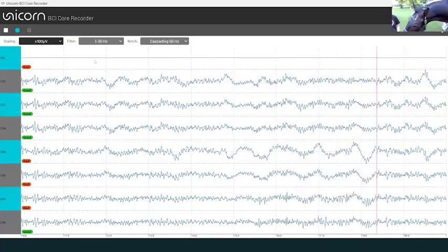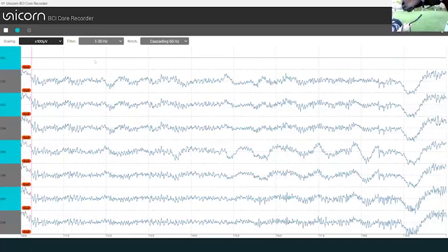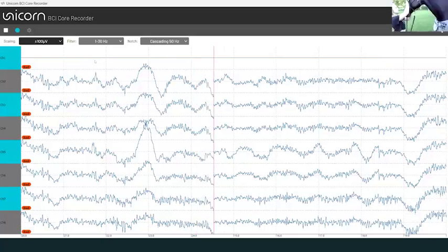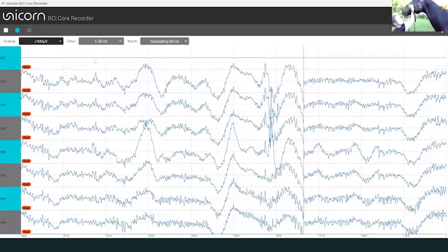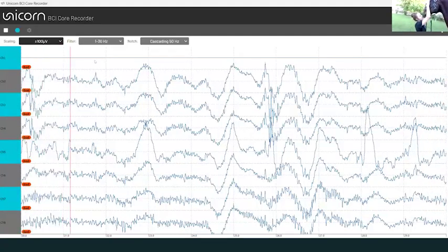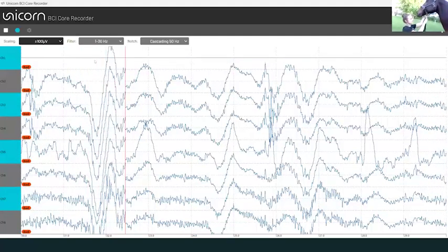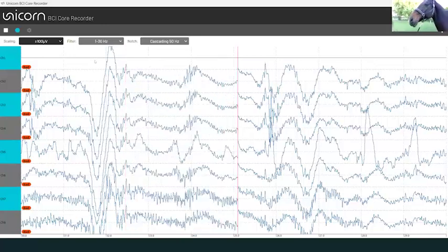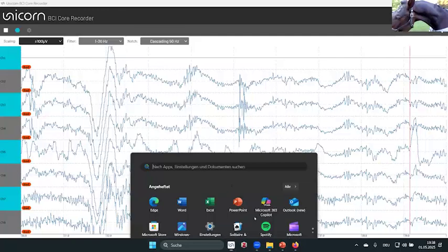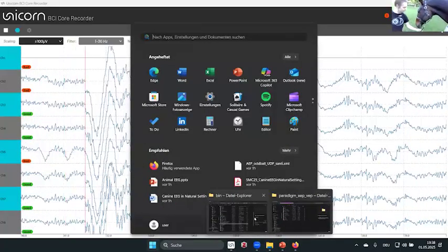Maybe you can try to close the eyes if you want to. I can try. So we have now closed eyes. So we try that. Maybe you can see them, higher amplitude. Oh no, again.